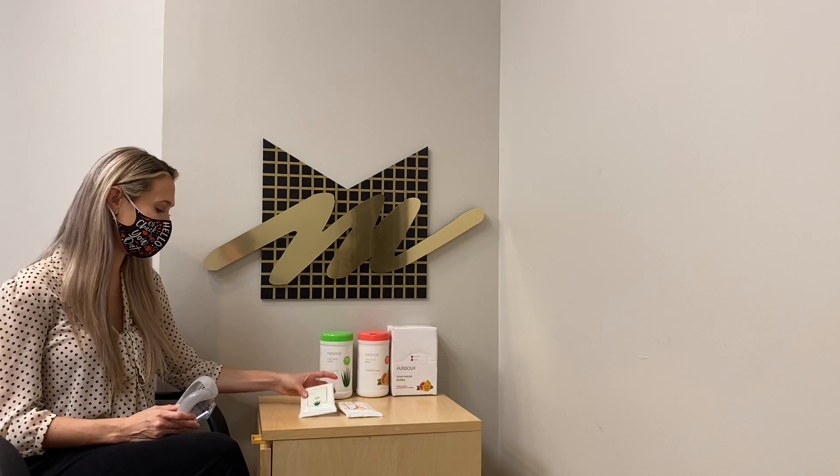Hi, I'm Lauren from Monitor Medical and today we're going to talk about our CPAP mask wipes.